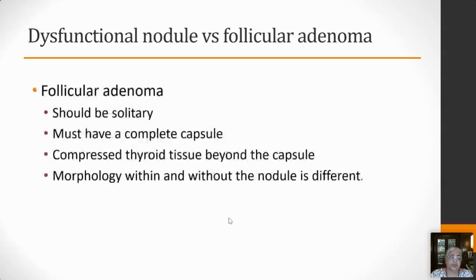Dysfunctional nodule versus follicular adenoma. If you go to the textbooks, they will tell you that a follicular adenoma should be solitary. It must have a complete capsule. Compressed thyroid tissue should be seen beyond the capsule. And the morphology within and without the nodule should be different. Now that's the standard definition of a follicular adenoma.